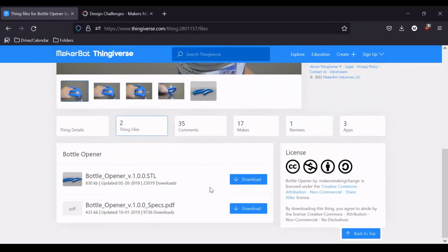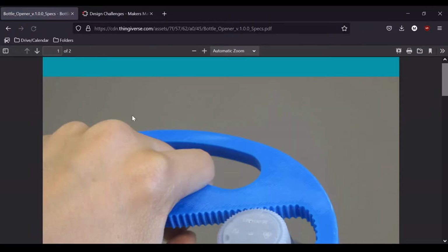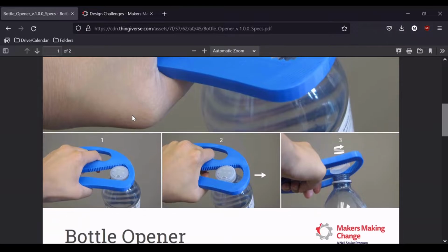Now if we go over to the thing files, there's two files here in this particular case. So we have the bottle opener, that's the .stl file, so that's what we'll actually be printing out. And there's also a PDF that has the specs of the file. So in this case, we'll go ahead and download the STL. And I'm going to go ahead and download the PDF just to see what's inside of it.